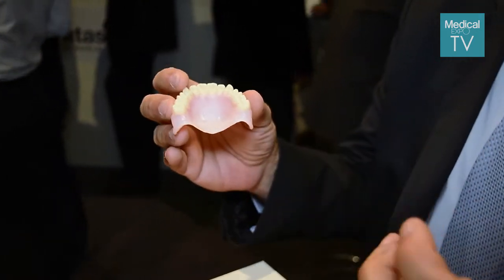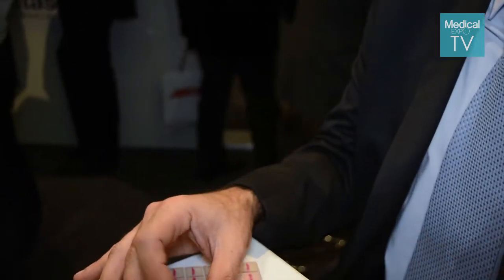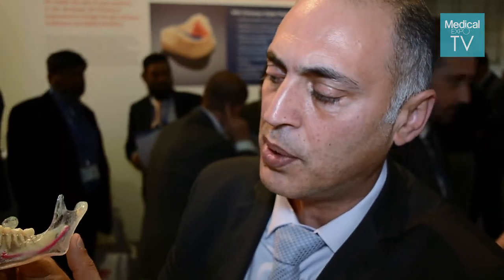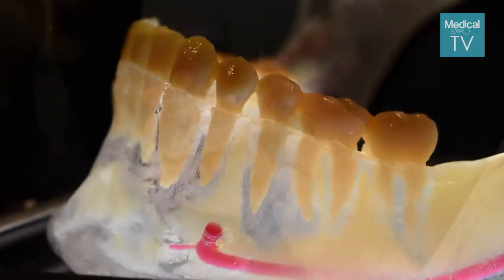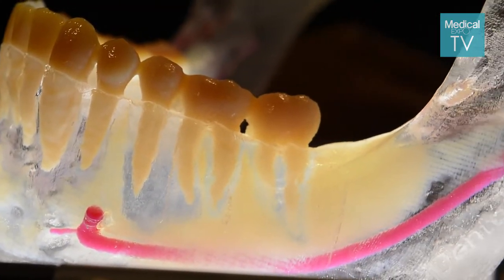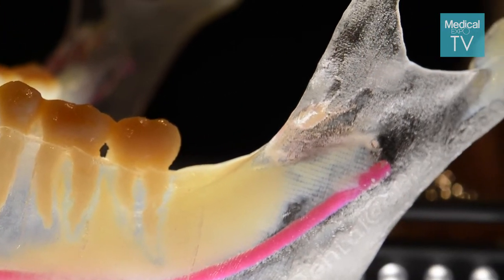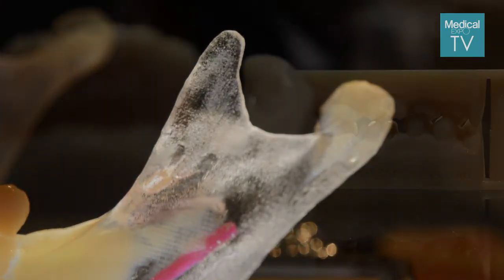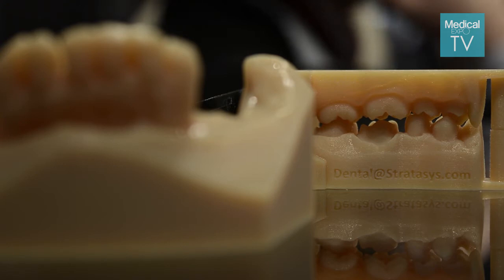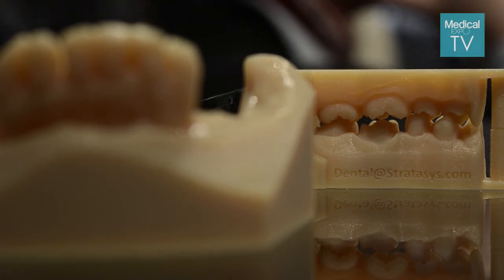On top of that, the technology enables support for different types of implant solutions. If we take a good look at this jaw — it comes from a CT scan — you can see the teeth are printed in A2 shade, the jaw in a very clear material, and the nerve canal in a different color. All this together gives the dentist the ability to plan and design any implant operation.